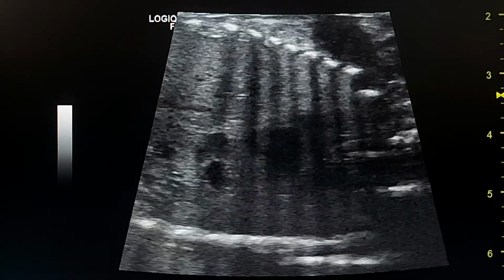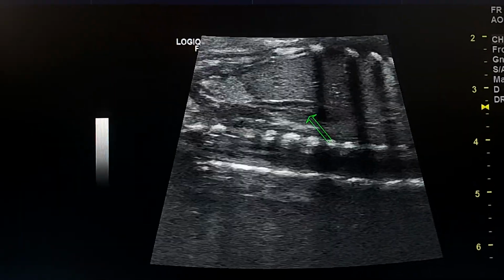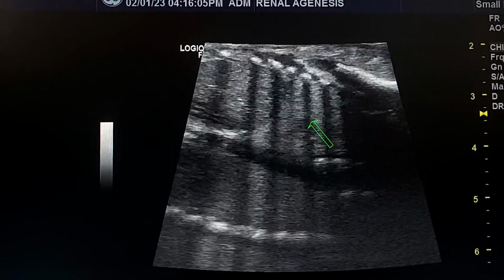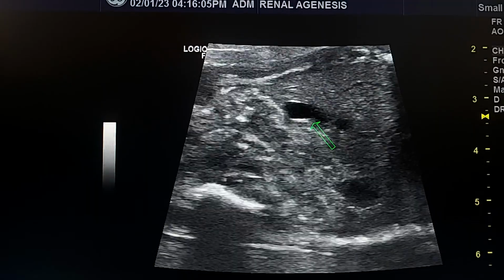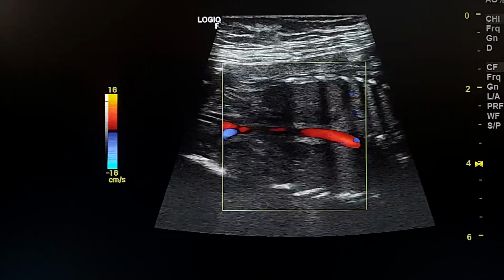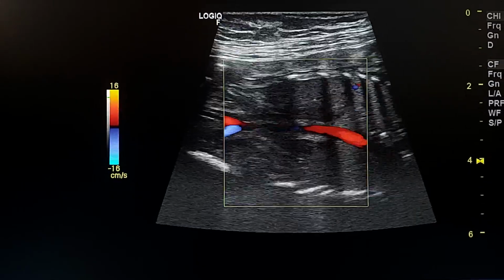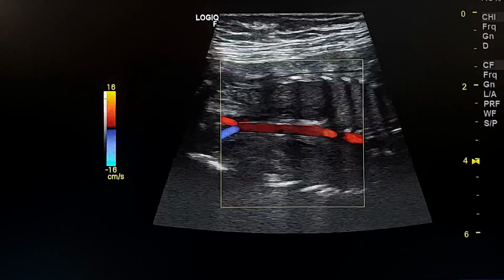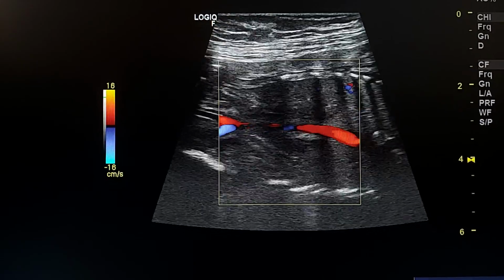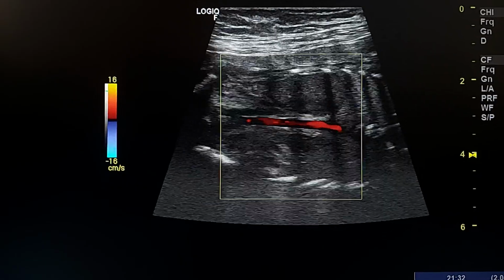Bilateral renal agenesis. The lying down adrenal sign is a cross-sectional imaging sign of renal agenesis or ectopia, in which the ipsilateral adrenal gland appears to be lying down on the psoas muscle posteriorly.